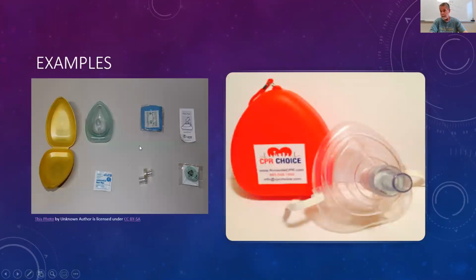These are some examples. This is a pocket mask. Those little devices, just like what I was showing you here, can be great if you actually have those. But we also have to consider: an adult goes down, and there's no barrier device for me. If I do compressions, call 911, and potentially get an AED, we can have some really high survival rates for those patients.